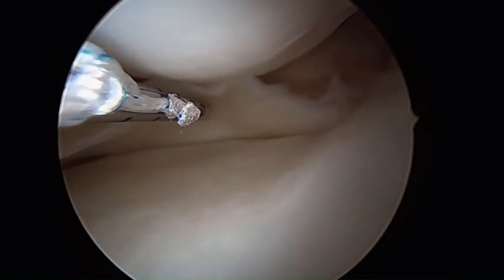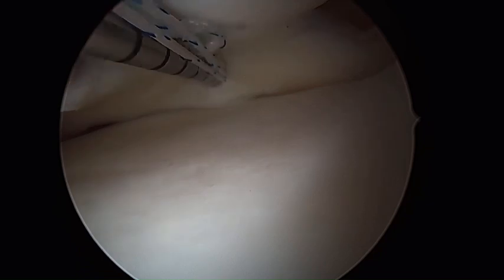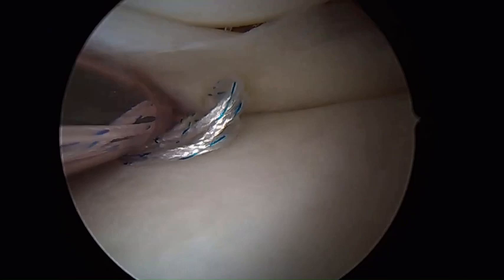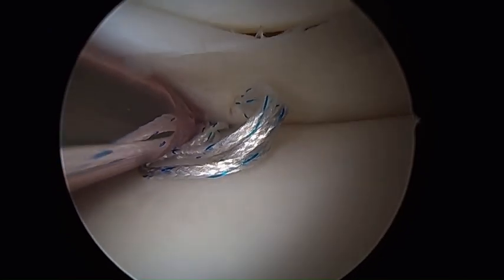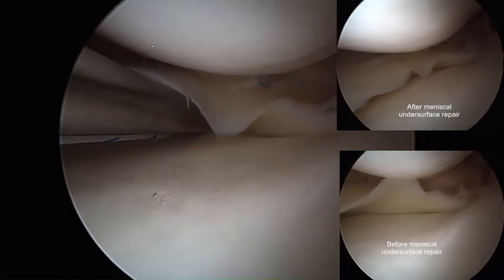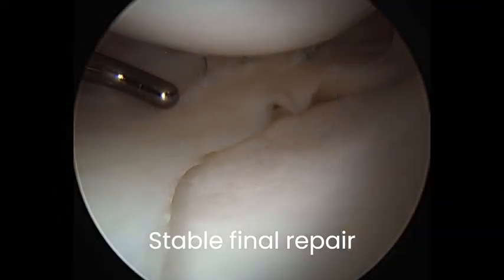Next, the meniscotibial ligament is repaired by introducing the reverse FosTFix flex needle to the undersurface of the meniscus. The first needle is curved up and passed through the body of the meniscus, and the second needle is passed down to the meniscotibial ligament. Tightening of the knot will push the meniscus down to the tibial plateau. A probe can be used to check the final stability of the repair.